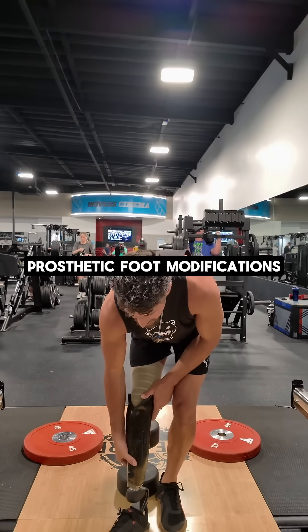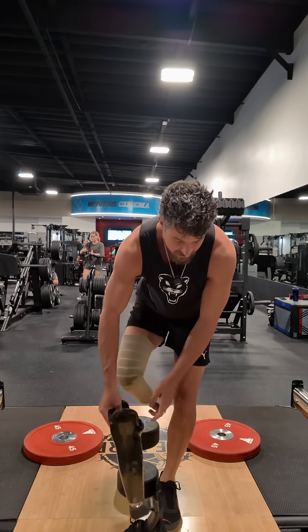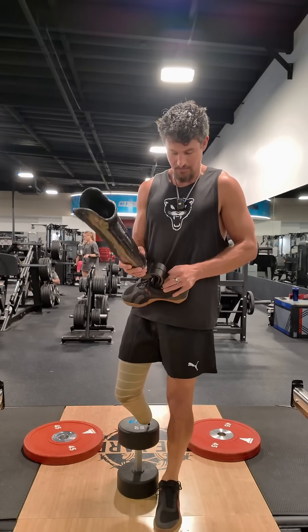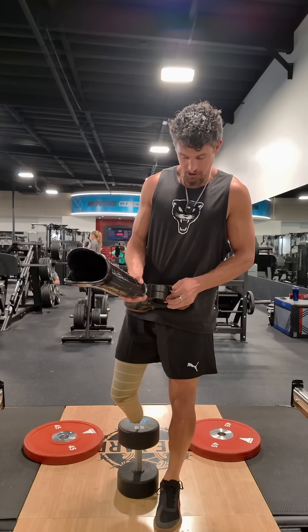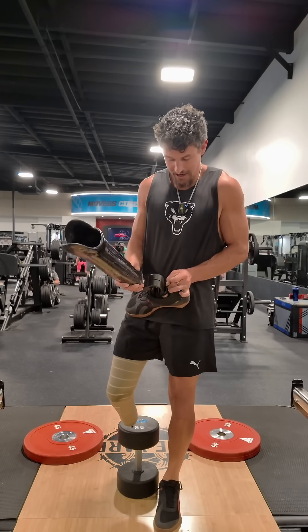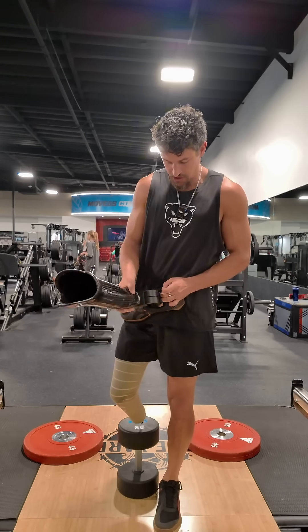All right, so check it. Using the Pro Flex Terra, this is what I learned to get more ankle flexion when I'm doing lifts and stuff. There's a heel pad in here and you can switch the stiffnesses. I'm just going to remove the heel pad — it's a little difficult with the shoe on.